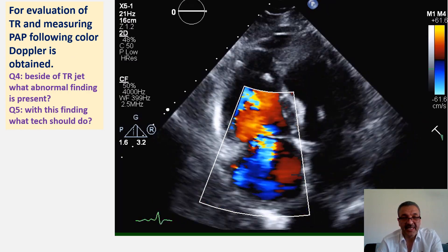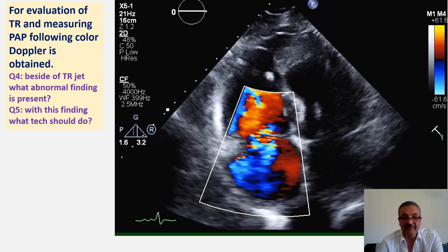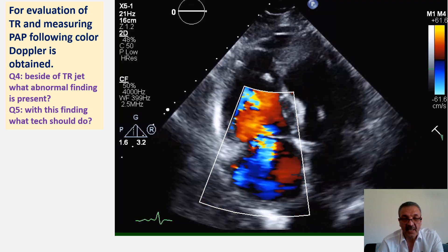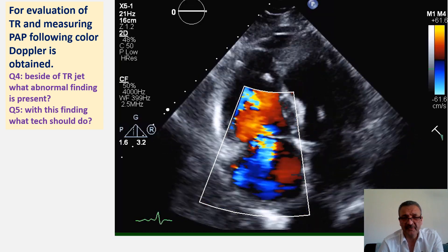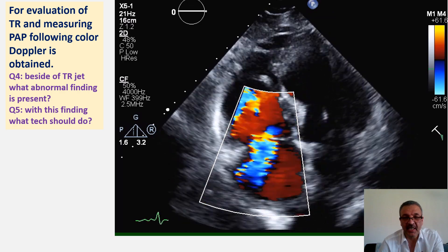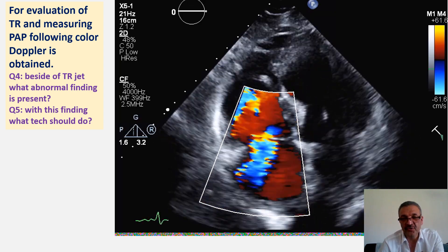Based on those primary images, a Doppler scan for tricuspid regurgitation has been taken to evaluate pressure. As you can see here, beside the TR, question four: what other abnormality can you see?